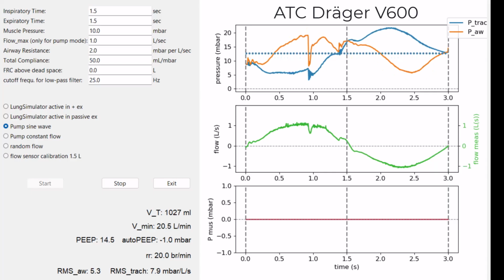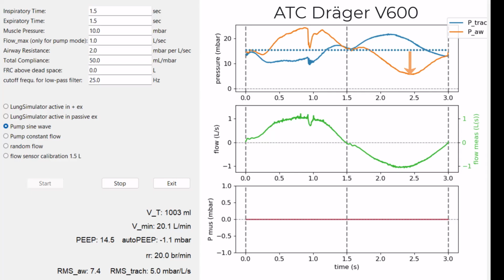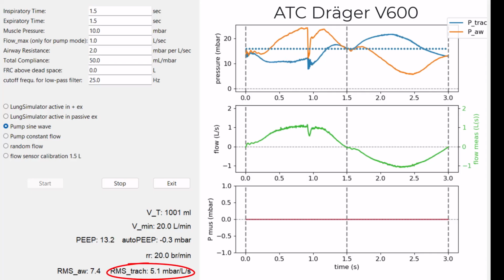Expiration not quite enough, and now I have a PEEP of 15 centimeters of water or millibar, and now we get the maximum tube compensation also in expiration. But as you can see, the tracheal pressure still deviates from our target pressure, the blue line, substantially, and the effective resistance is about 5.1 millibar per liter and second.